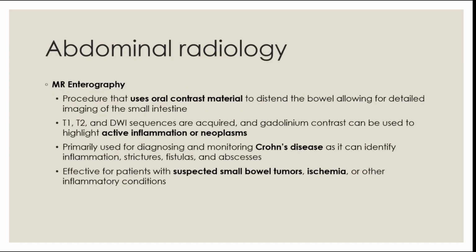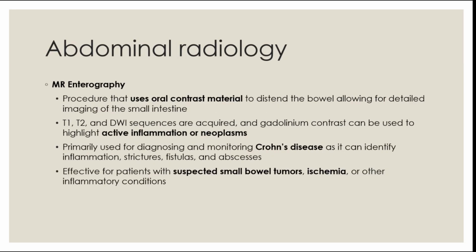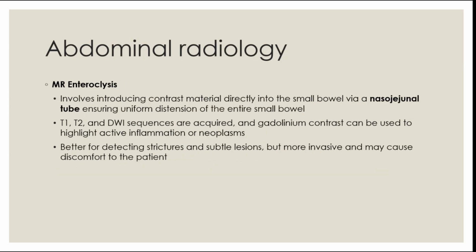So if you're trying to distinguish between them, enterography is less invasive than enteroclysis. Enterography is mainly for evaluating active inflammation or neoplasia, Crohn's disease, fistulas, strictures, or inflammations. Enteroclysis is similar, but it has higher sensitivity to tumors, strictures, and inflammations. But it's more invasive, and you're causing more discomfort to the patient.